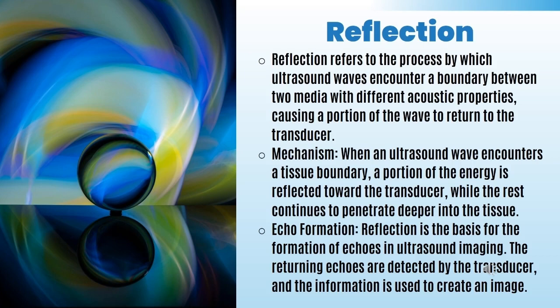Reflection refers to the process by which ultrasound waves encounter a boundary between two media with different acoustic properties, causing a portion of the wave to return to the transducer. The mechanism happens when an ultrasound wave encounters a tissue boundary. A portion of the energy is reflected toward the transducer, while the rest of it continues to penetrate deeper into the tissue.